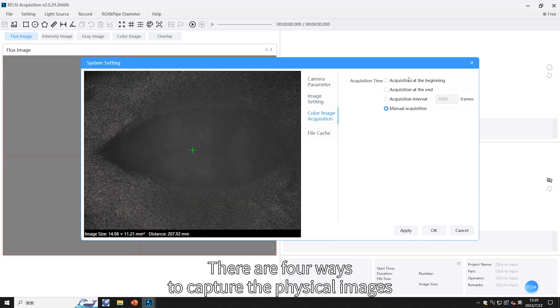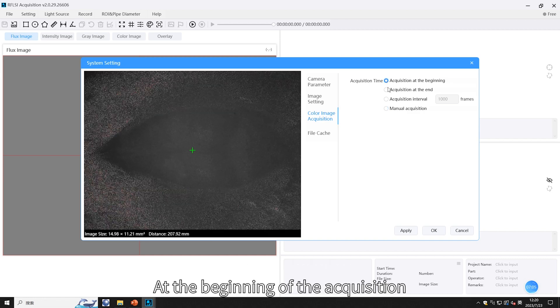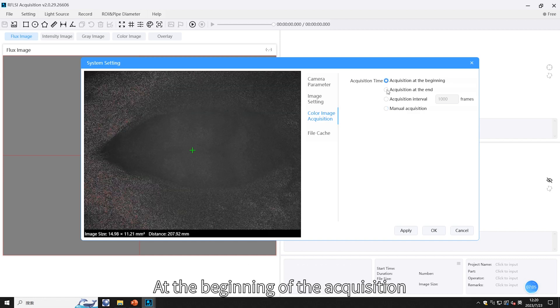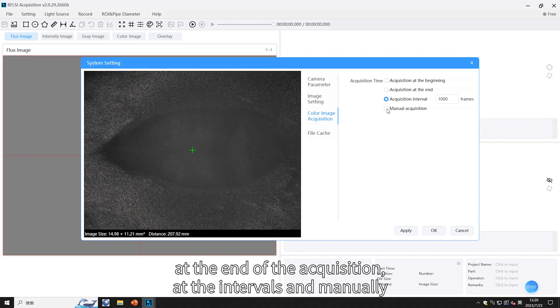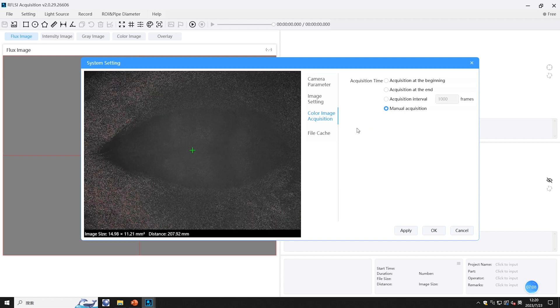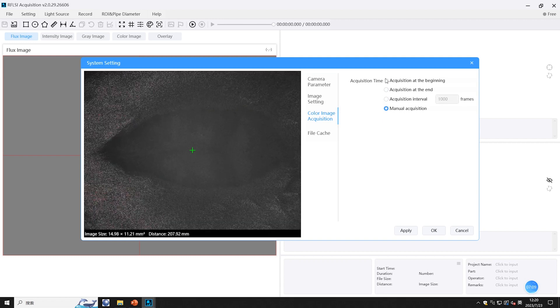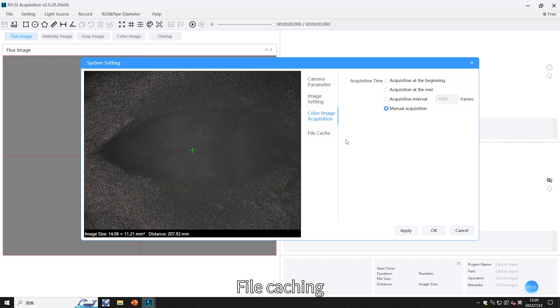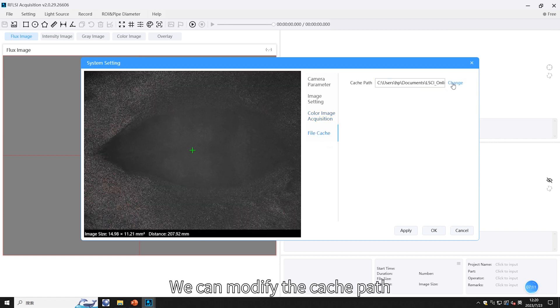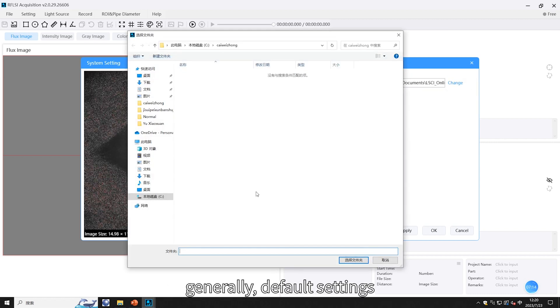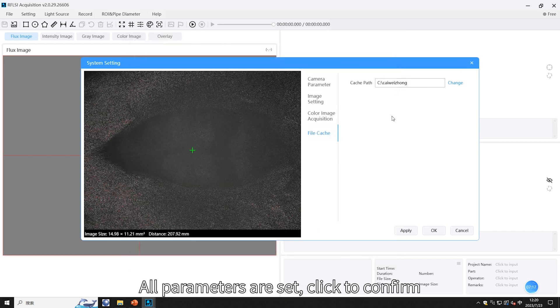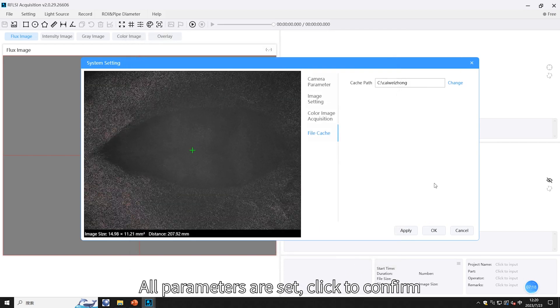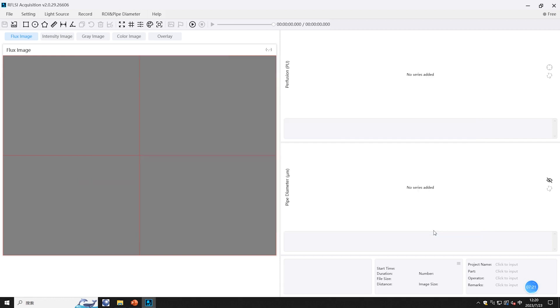There are four ways to capture physical images: at the beginning of the acquisition, at the end of the acquisition, at intervals, and manually. For file caching, you can modify the cache path; generally the default settings are used. Once all parameters are set, click to confirm and then click to start recording.